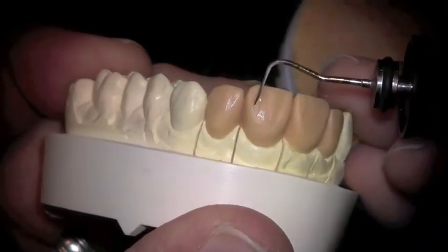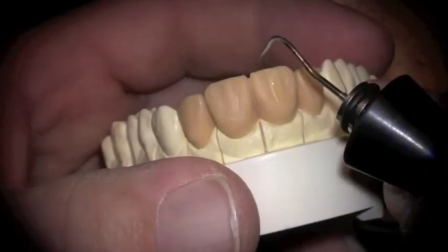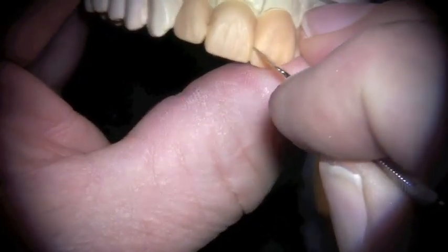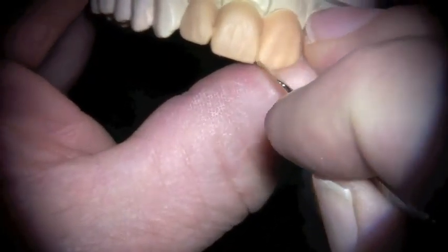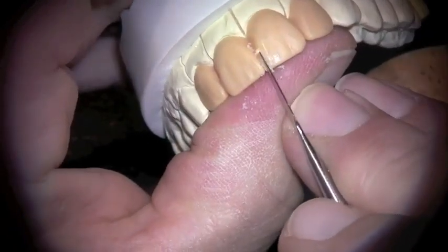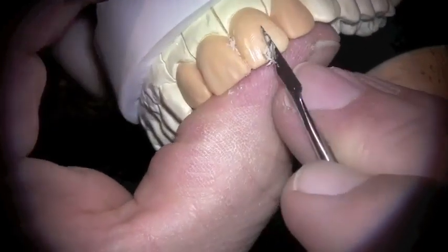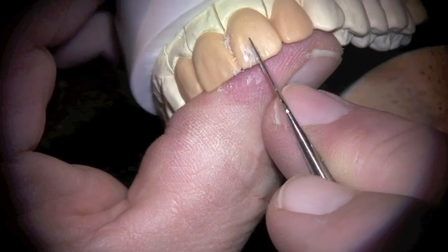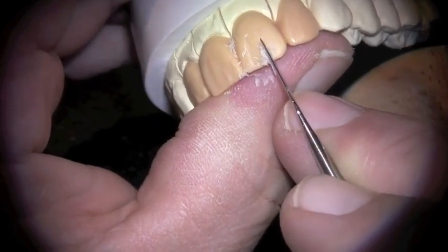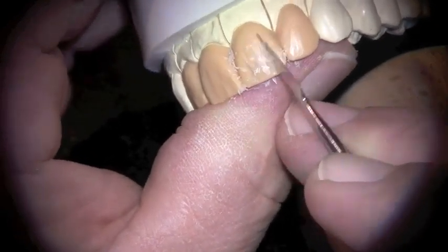From there, we'll start tuning these by adding wax and carving and create a shape that we feel will be appropriate. I felt like the incisal edge shape was a little short there. I'll start with the midline, always getting the midline embrasure vertical, and then start controlling that transition from embrasure to facial surface and getting the mesial lobes set up in the right way to create the aesthetic result that we would like to see. We'll start working on surface morphology, and we'll start tucking in the distal here.